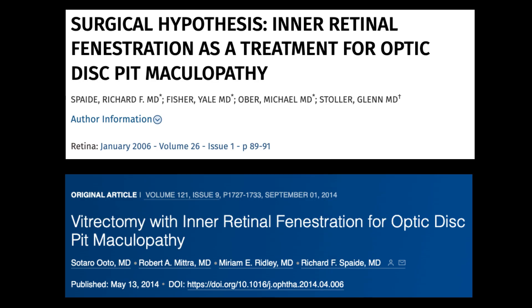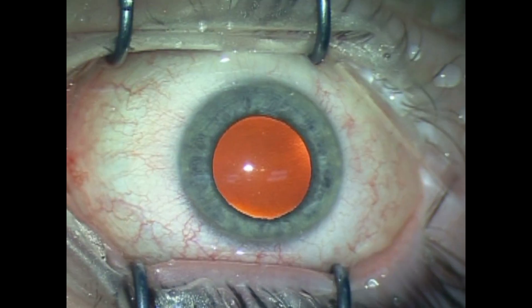Several techniques have been proposed, including vitrectomy with various adjunct techniques. Inner retinal fenestration was recently proposed by Spaide and colleagues. This technique may help to redirect the flow of fluid into the vitreous cavity instead of into the retina.